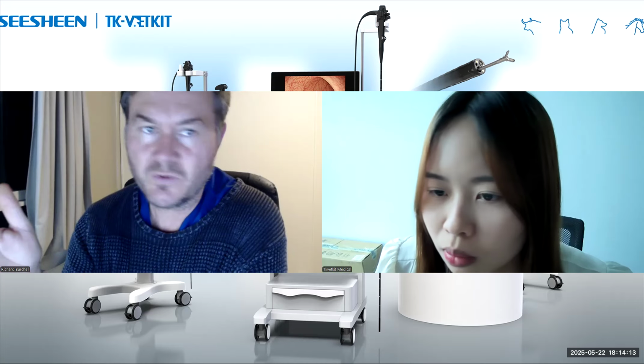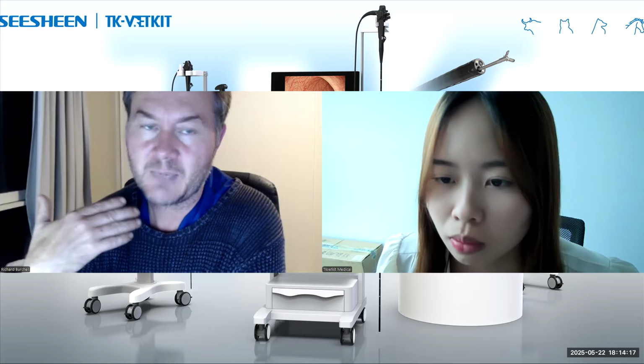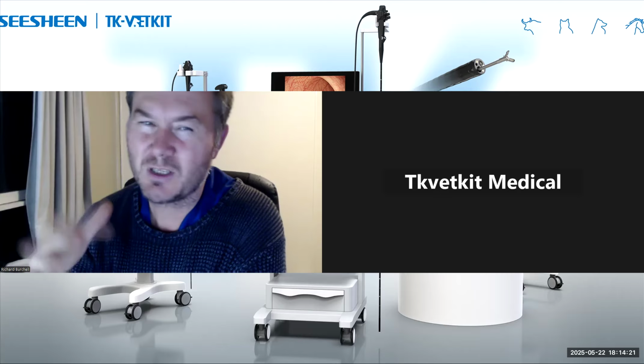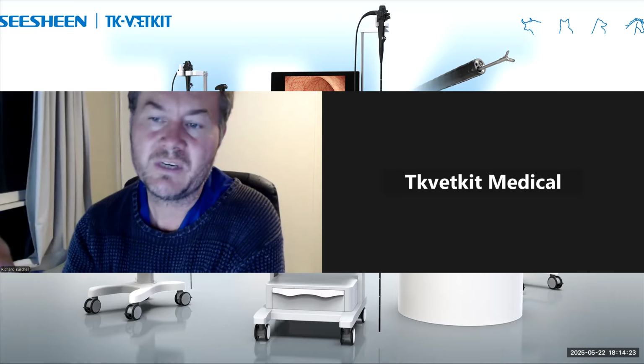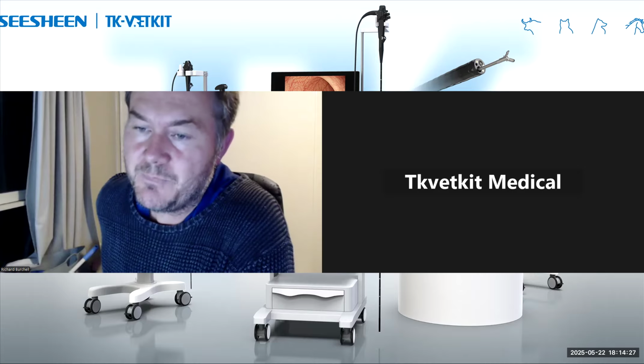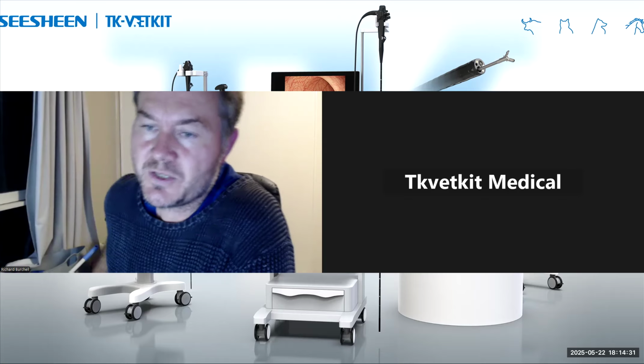I don't always use oxygen if I'm using a narrow bronchoscope in a big animal that's able to breathe. That's the short answer from a principle point of view, but it's not really something that I treat. And then major bleeds for rhinoscopy was another question.